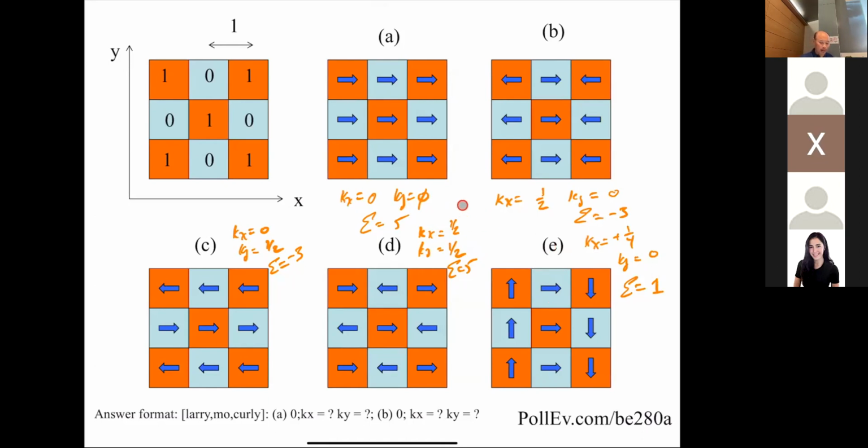In fact, we'll get to it later, but in MR, we deal with real and imaginary numbers all the time. For those of you who are double E's, it's basically quadrature detection. So we look at the cosine and the sine components and call those the real and imaginary parts.